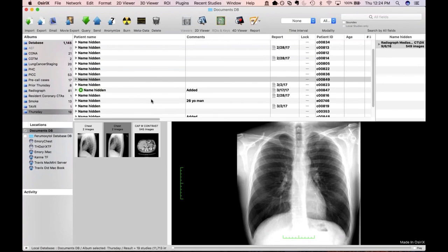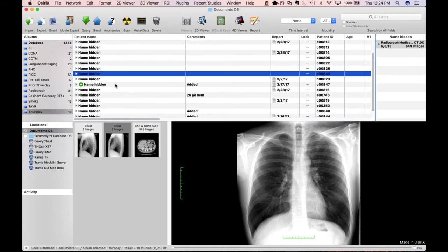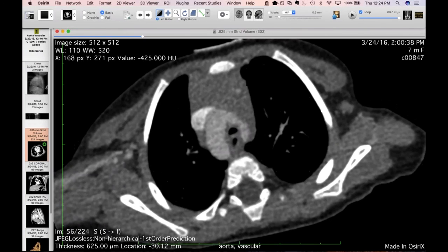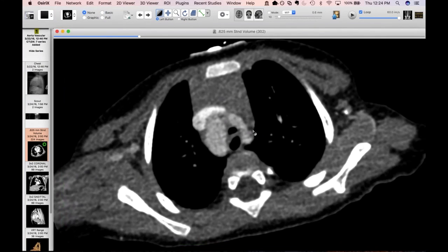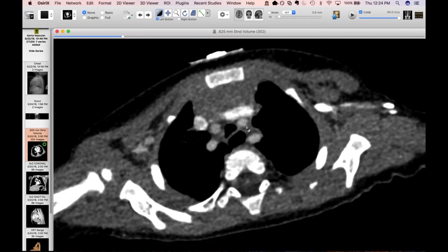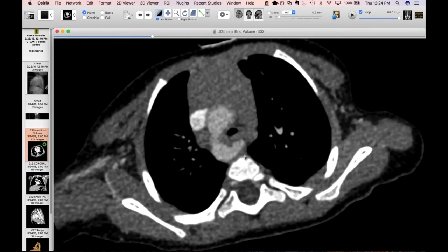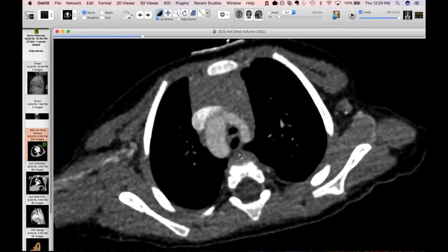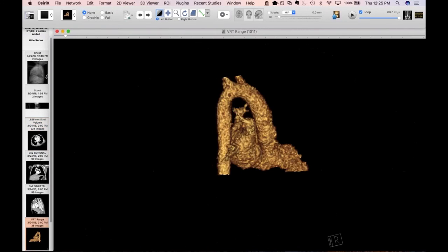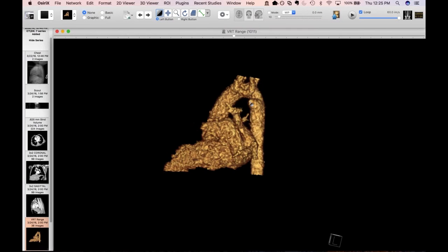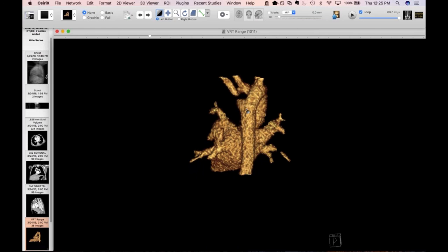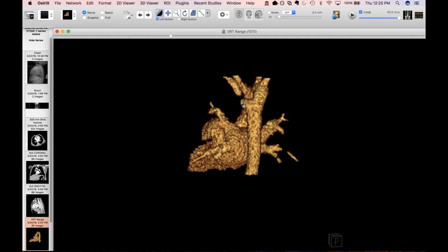I've been putting together a talk for Radiological Society on aortic arch anatomy. I wanted to go through a couple of these and tease out some subtleties. This is one that I used to think was a double arch with mirror image branching, but we know this is a very strange configuration — essentially a four-vessel arch with what looks like a Kommerell diverticulum or dimple posteriorly. You can see tethering of the left subclavian artery. This is a young patient who was symptomatic from this vascular ring and went to surgery. This was a double arch with an atretic segment, which mimics right arch with mirror image branching.